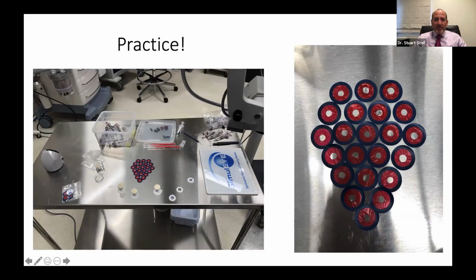I grabbed some instruments, some viscoelastic that we save sometimes at the end of cases. If I know I'm going to need to use some, we'll just use any viscoelastic that maybe got open but didn't get used. It's going to get thrown away. We'll grab that. You can use other sources of gel. And look, here's 22 tears. They're not perfect, but they're perfect training, right?